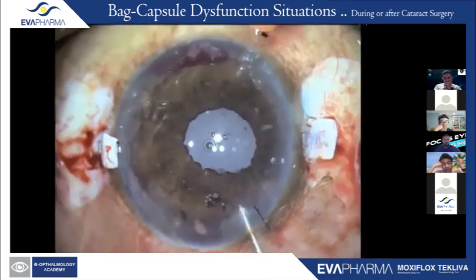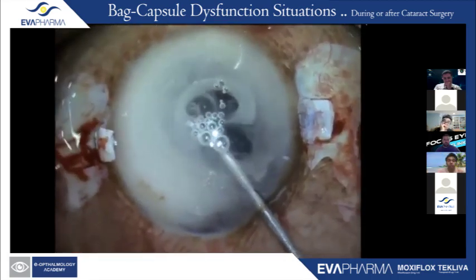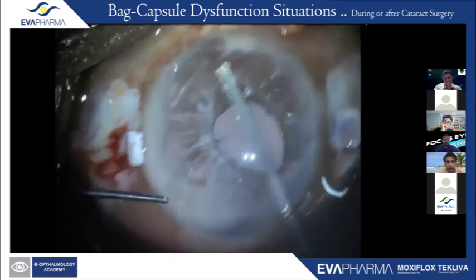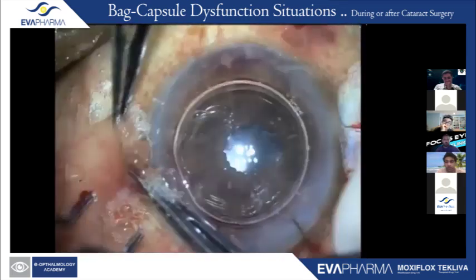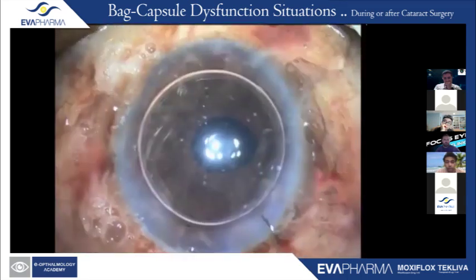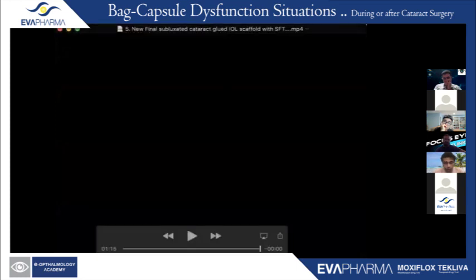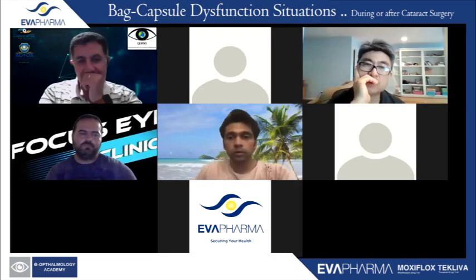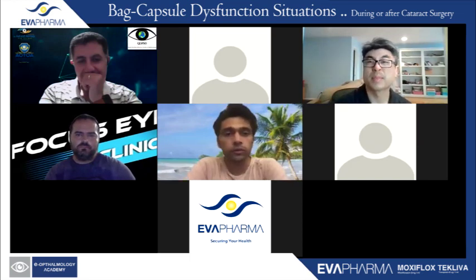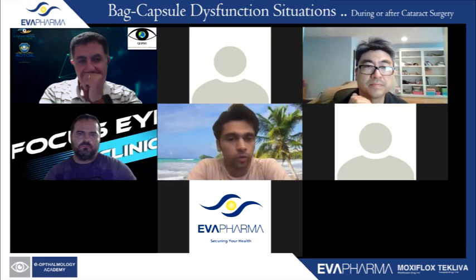I didn't even use phaco power in this, honestly. It was so soft that you were able to do this without any hindrance, and it pretty much becomes a very simple case where you've actually created your own posterior capsule by placing that lens. And this is the first day post-op. I wanted to show that, even though it was not a clear image, because it really helps in identifying that you can do phaco even though you've created your own posterior capsule.